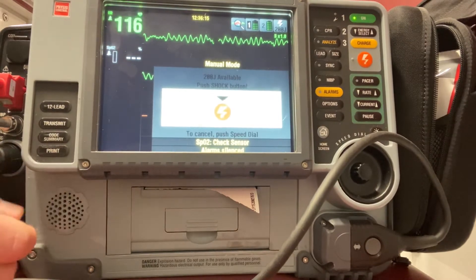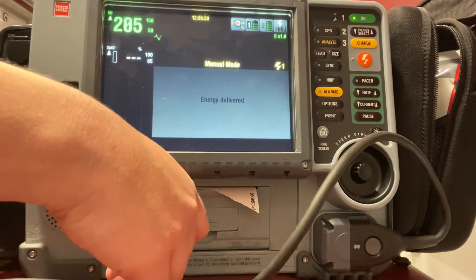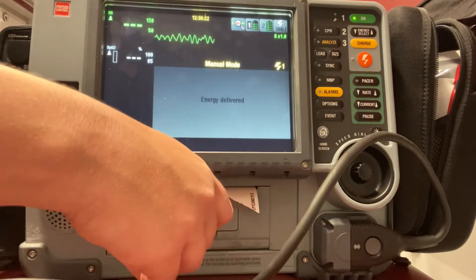I'm clear, you're clear, we're all clear. Go ahead and hit the shock button. Shock is delivered. And then we'll go ahead and resume CPR.